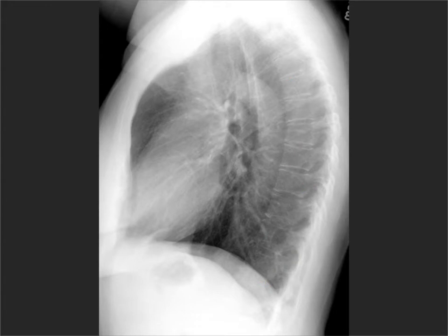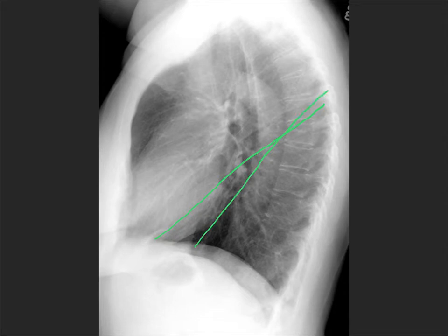Now you may or may not see the fissures in a patient, but you will have the major fissure on both sides. The left one tends to be a little bit steeper than the right one. You tend to see them if they're a bit thickened or there's fluid on, or you look really closely on a good quality study. The minor or horizontal fissure on the right side is going to be sitting like this.